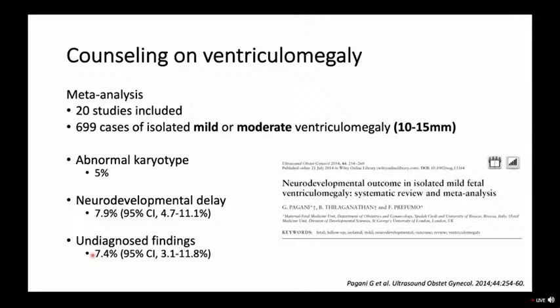So takeaway, mild, moderate ventriculomegaly under 15 millimeters. Yes, there is a chance the baby may have some medical complications, but 95% of the time, the baby is going to do perfectly well.